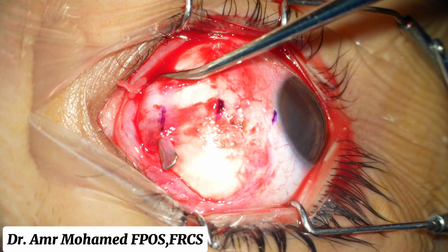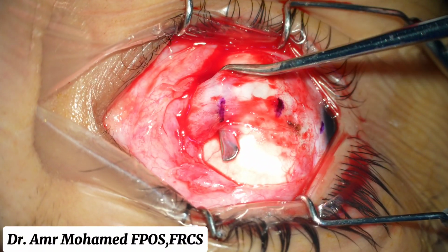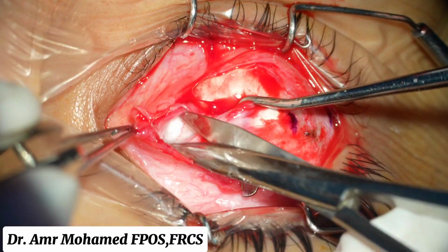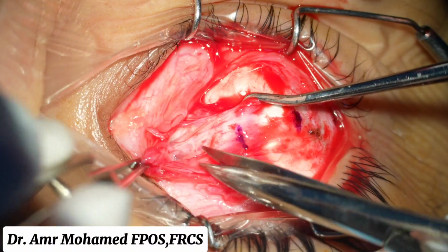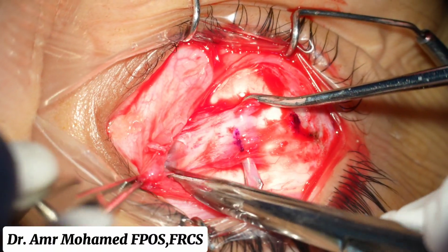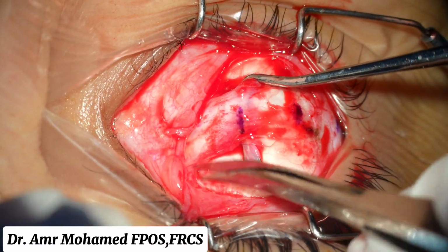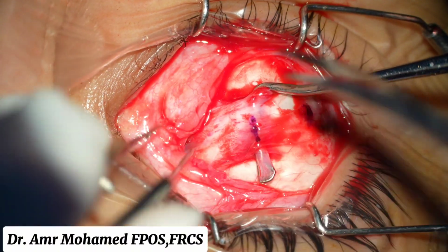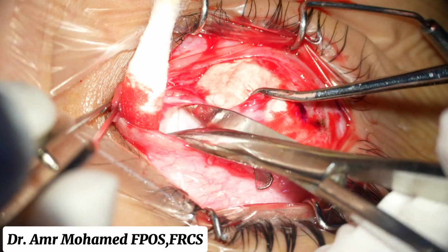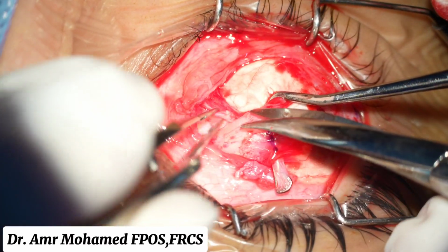In large measurements beyond 6 or 7 millimeters, it's preferable to do the measurement two times, so you will have more accurate measurements. You need to reach the proper muscular tissue, so when you are isolating the muscle, you will isolate true muscle, not the tenon capsule, so the risk of stretched scar or muscle slippage will be less.